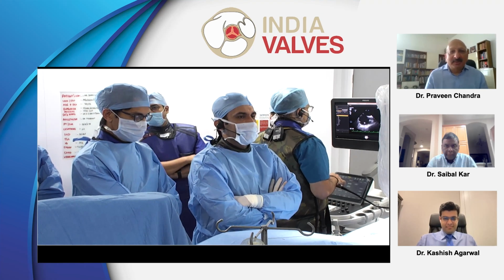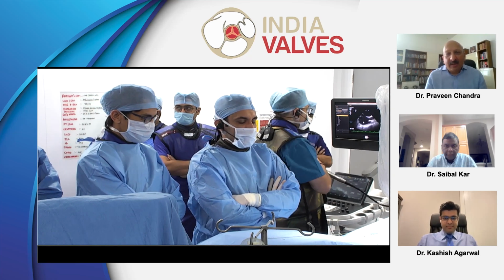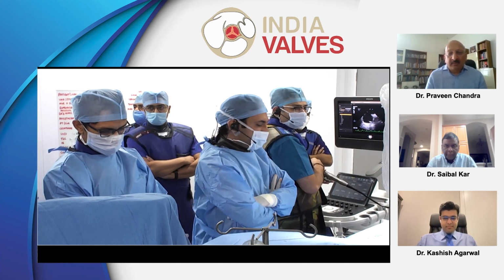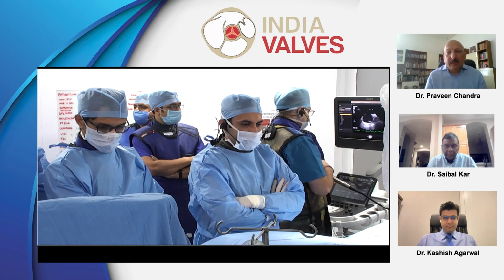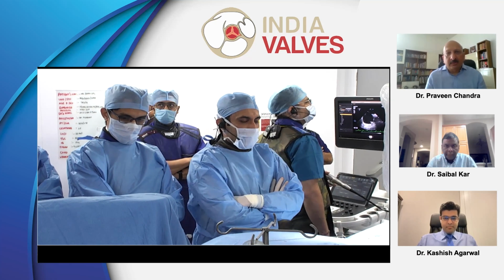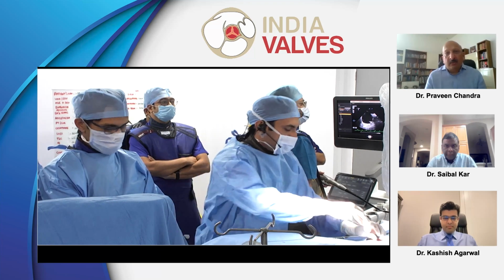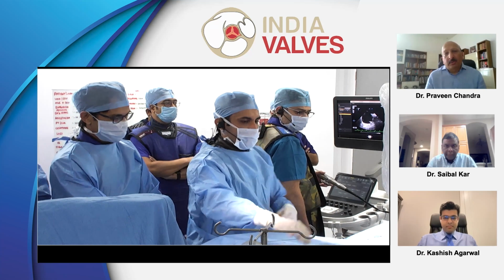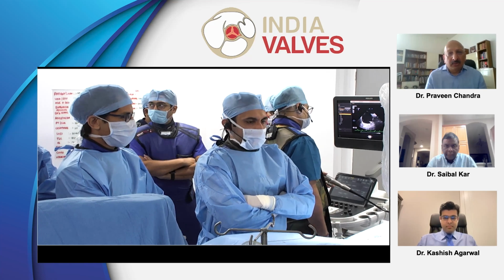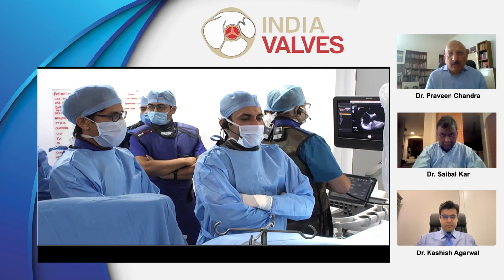But let me now take you to Jaipur straight away. And here we have a fantastic operator, Dr. Ravinder Rao. Everybody knows him now. He's one of the finest structural heart exponents in India and, of course, well known abroad. He's going to share with us a case of MitraClip, which is very well established now after the COAPT trial. And we will see the nuances, the steps of how a MitraClip is done, and he will show it to us step by step. So, a very warm welcome, Ravinder and your team over here.